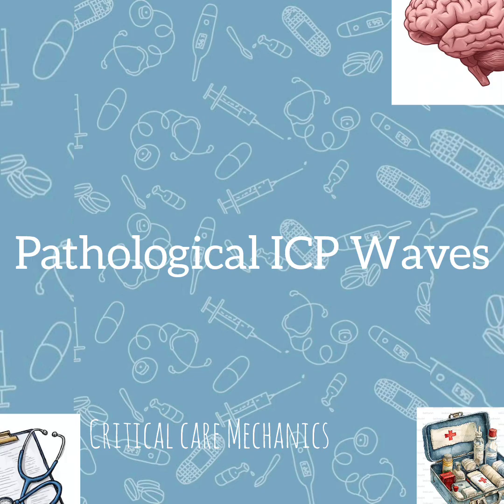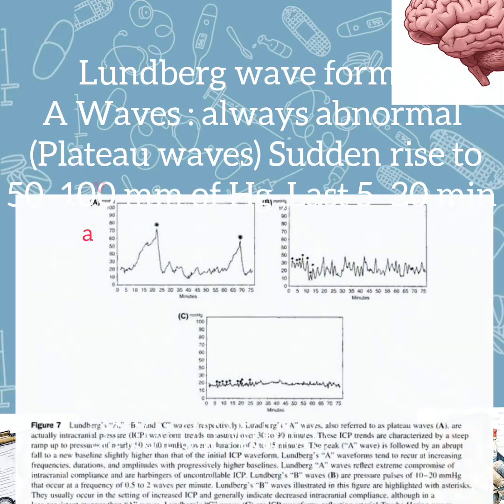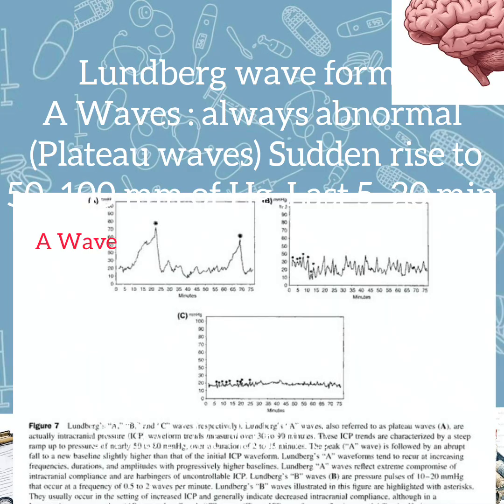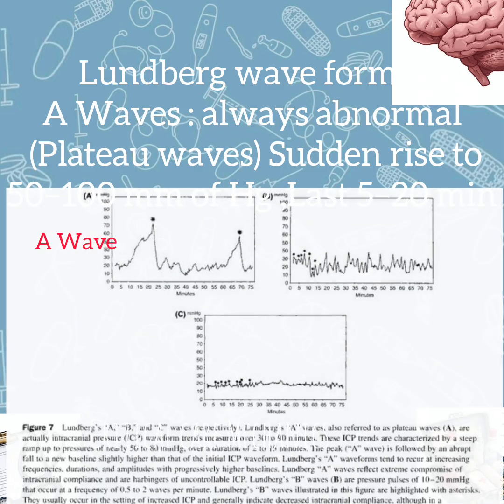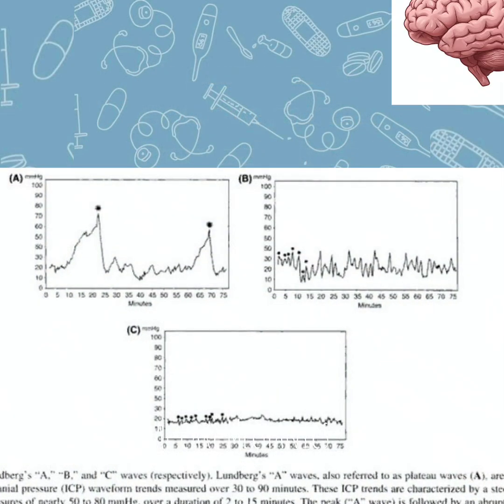Pathological ICP waves: Lundberg waveforms. A waves, always abnormal, plateau waves. Sudden rise to 50 to 100 mm of mercury, lasting 5 to 20 minutes. Very dangerous, means impending herniation.